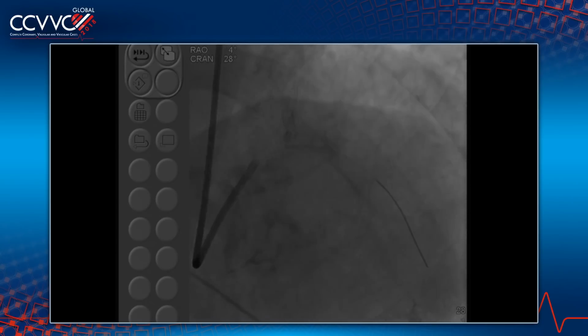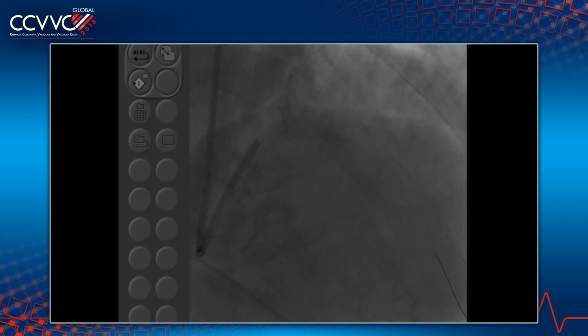So rewire now. And you rewire, and of course you kiss, which is very important. The wire is destroyed, give us a new wire. Okay, the wire looks pretty destroyed. Yeah, new wire. And that's the thing, when you want to recross, always try to use a polymer coated wire. It's much easier to recross.